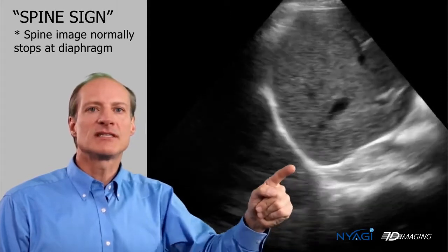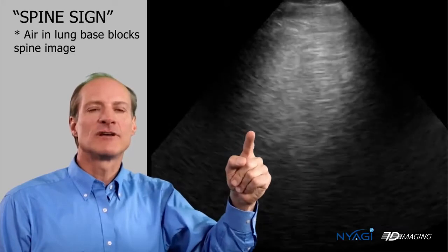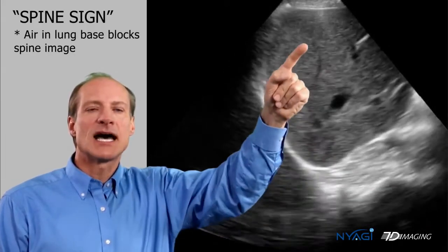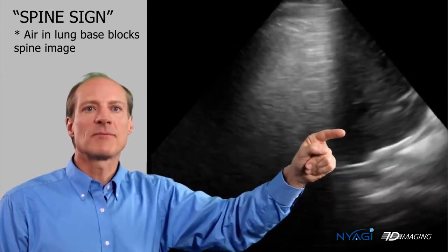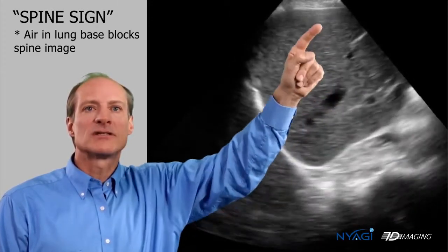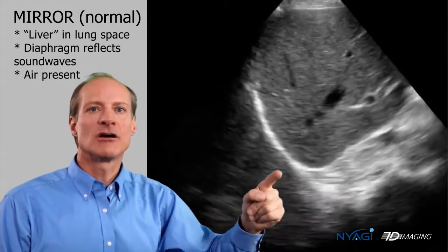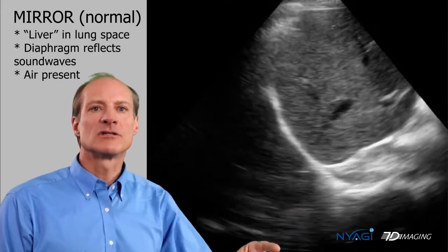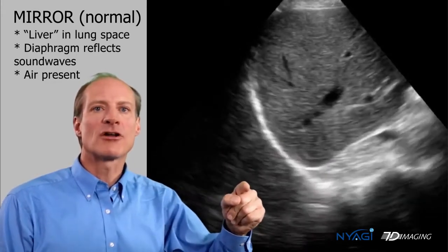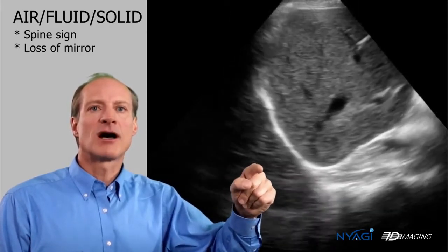That's because in this image, the lung at the base is filled with air. Air does not transmit sound waves well, so the signal will come down, reflect off of the diaphragm, make a couple of bounces, then go back up to the probe and record it. That long distance will recreate an image of the liver superior or above the diaphragm. That's normal. It's called a mirror artifact. Using the mirror artifact will confirm air in the bottom of the lung.